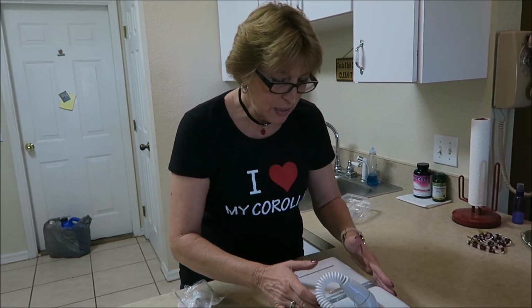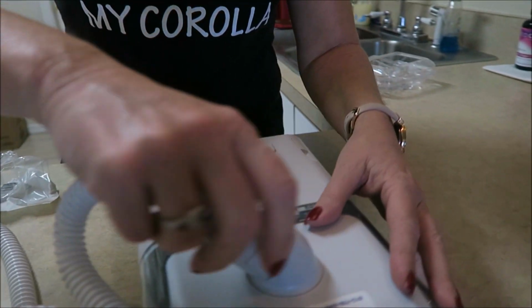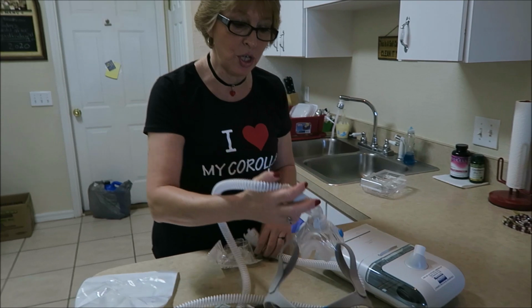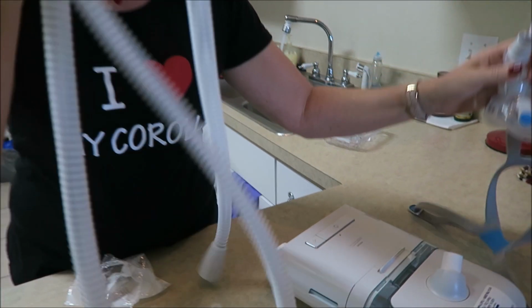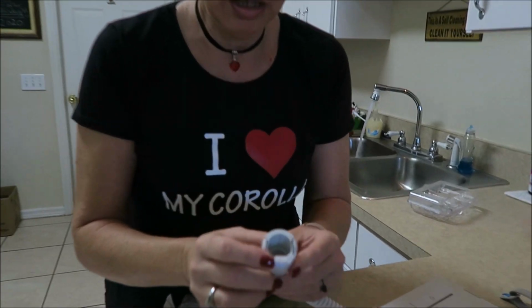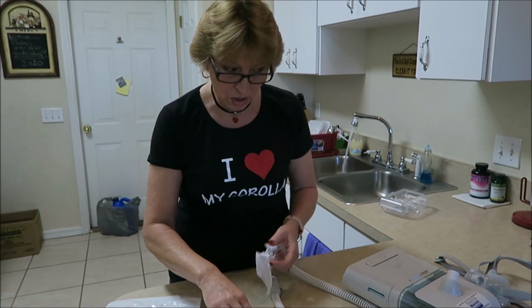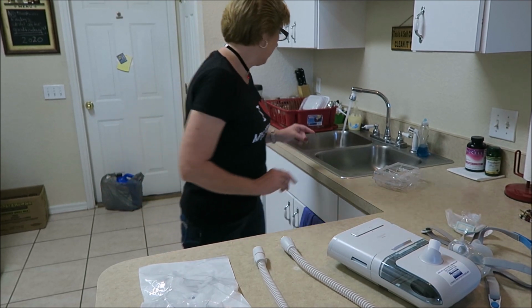So we're going to close this back up. Here you have 2 buttons on each side. I'm going to show you. You squeeze it and pull it out. This is the tricky part. Because there are electrical wires in here, they tell us not to really submerge this part for too long so we don't ruin it. So this is how I do it.